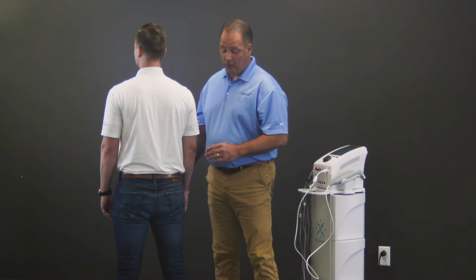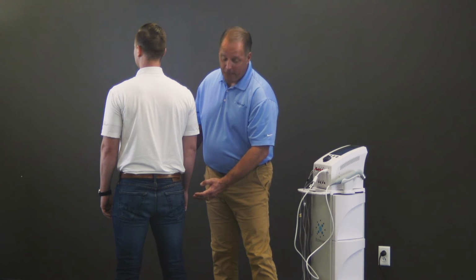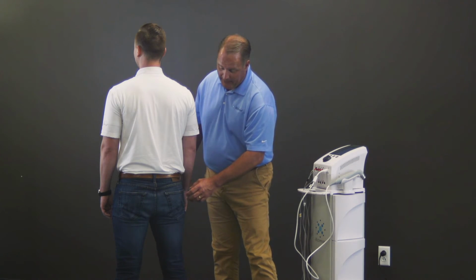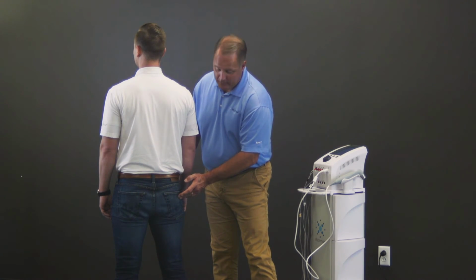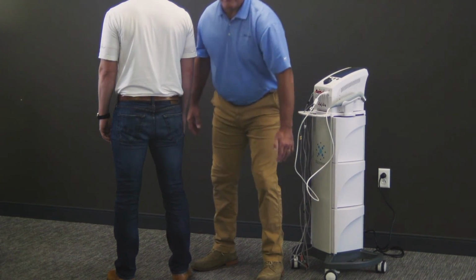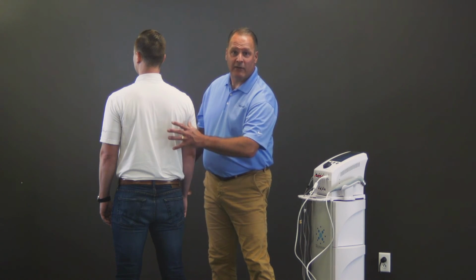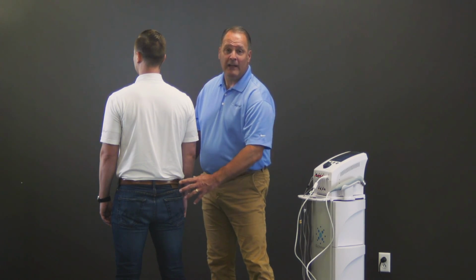With the second channel, normally we have sciatic pain or what they call piriformis syndrome, where the muscle gets inflamed where the sciatic nerve comes out. We'll put one pad of channel 2 and create a very long X on the inside of the leg. It allows that vector scan to move up and down the leg, subsequently treating all that referred pain down into the calf.